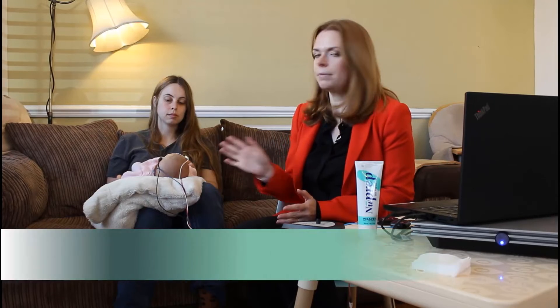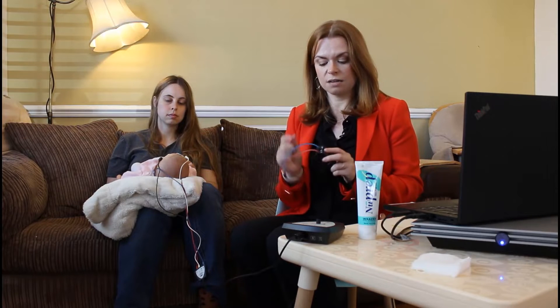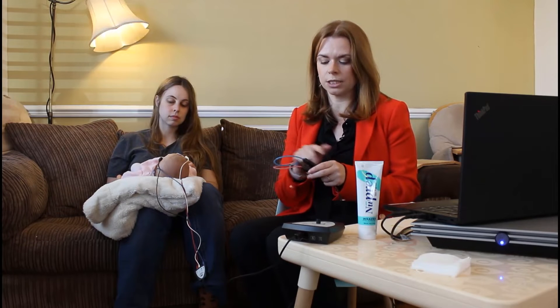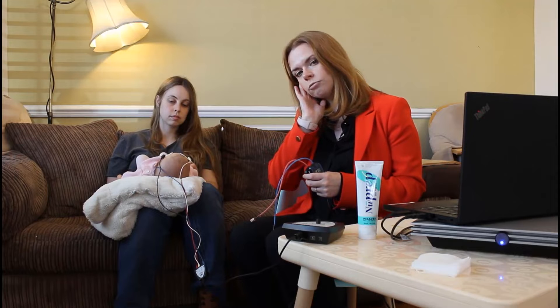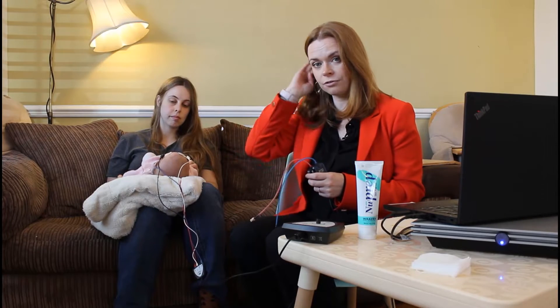We're ready to start testing. The baby has gone nicely to sleep. We need to get some transducers on her ears. Today I'm going to use insert earphones — the IP30 ABR insert earphones, which are electrically shielded, helping to reduce possible interference. She's lying on her right side, so we'll try the left ear first.